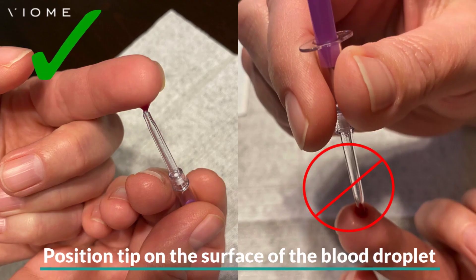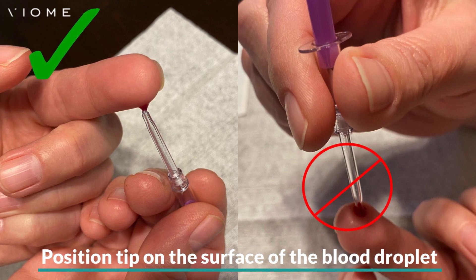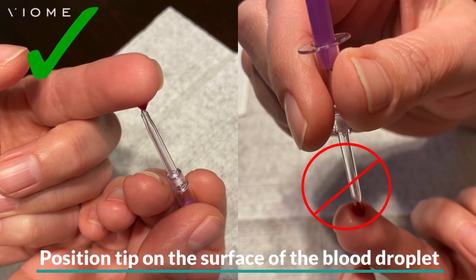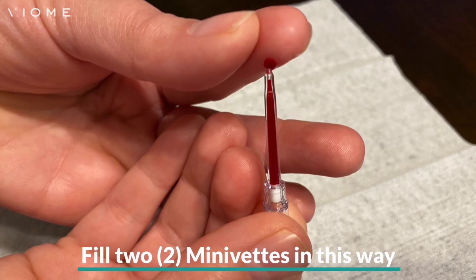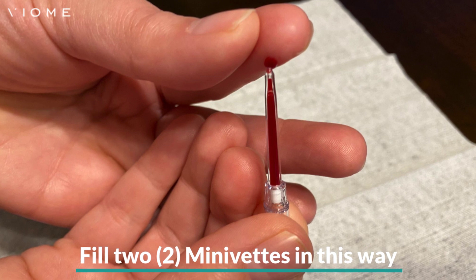Position the clear tip of the minivet on the surface of the blood droplet with the purple end of the minivet pointing downwards. Try not to push the tip into the blood droplet or against your skin, as this could clog the minivet. By placing the clear tip on the surface of the droplet with the end pointing down, this should allow the blood to flow directly into the minivet easily. Fill the clear tip of the minivet until the blood reaches the white filter.